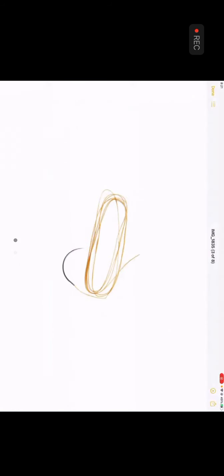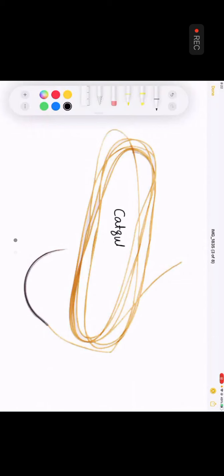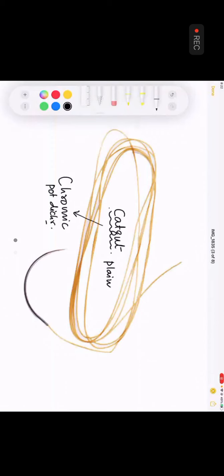Okay. Now, can you tell me what this suture is by the color of the suture? Undyed catgut. Very good. That's a very impressive answer, sir. This is technically a catgut suture. Those of you who said undyed, I should give you a chocolate. This is technically plain catgut. How to make plain into chromic? Simple. You add potassium dichromate. So the color then becomes deep brown.